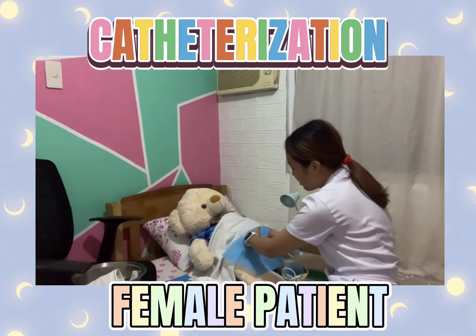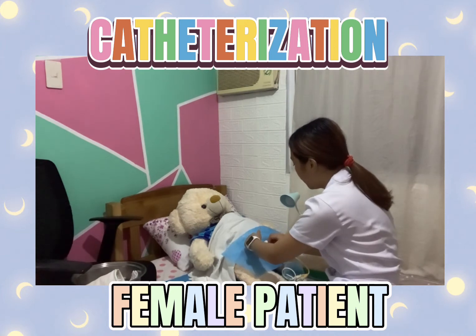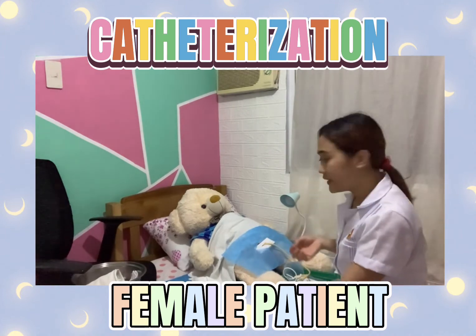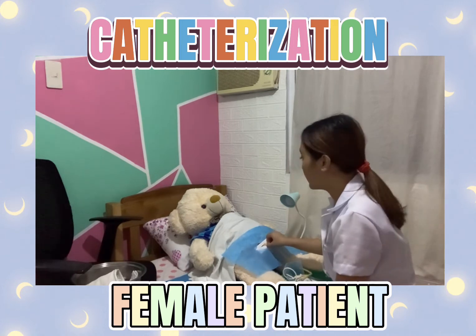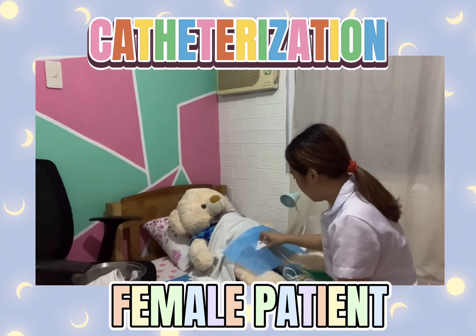When resistance is present, ask your patient to inhale deeply and then rotate the catheter. So, ma'am, inhale deeply po, and I will rotate the catheter po. Okay, that's good po, ma'am.